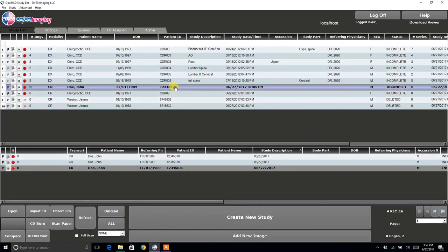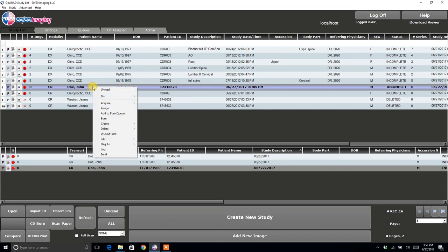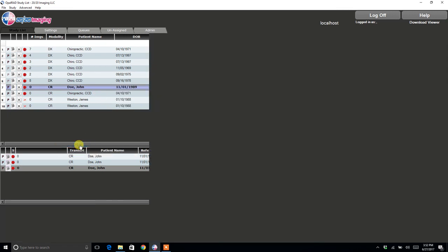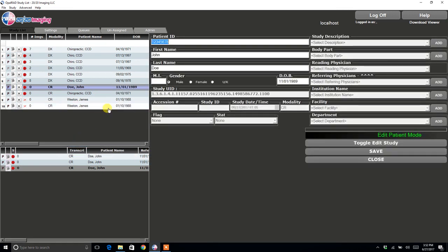Now, if you misspelled anything in the patient's demographic information, you can right click, go to Edit Patient. And it brings up the patient's information for you to correct. Once you are done, click Save.